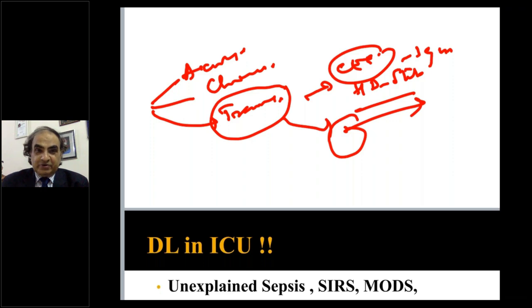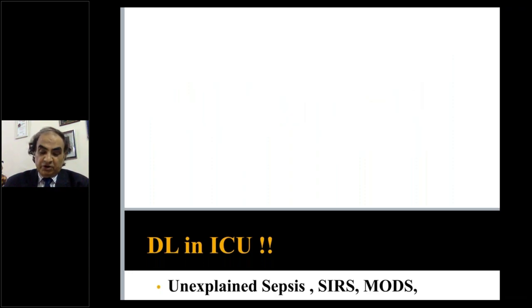right? And a very common question is asked when you're appearing for some fancy exams. Say you go beyond your routine MS or DNB, or you are having a good MS or DNB exam, because examination depends on many factors. How do you calculate what is the blood loss when you put in a scope? With the patient in a supine position, look for the deep ring.